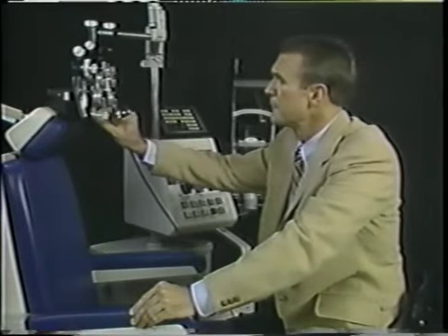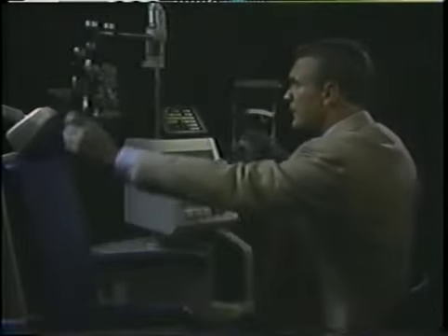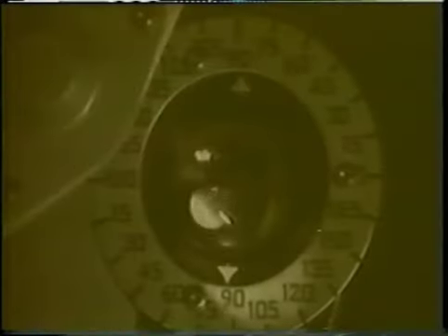It's good practice, though, to refine the cylinder axis and power retinoscopically first, for such refinement is easy and fast with the streak retinoscope. Let's leave a little axis error and power error so we can demonstrate these refinement steps more easily. For both refinement steps, we need definite with movement in all meridians, so we lean a little forward a few centimeters to obtain it. First, we refine axis.